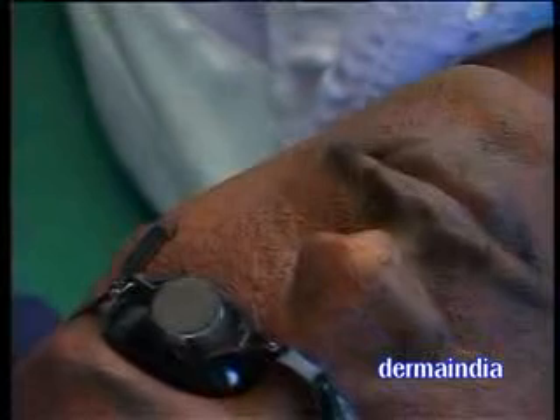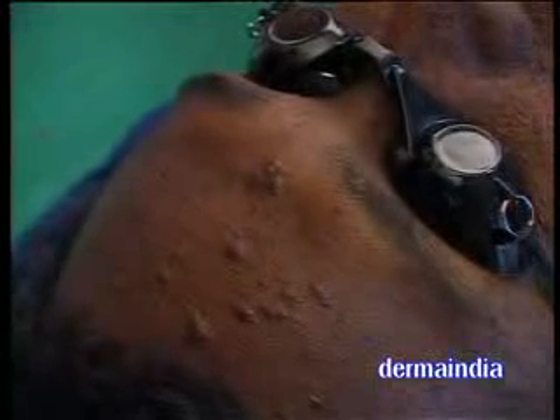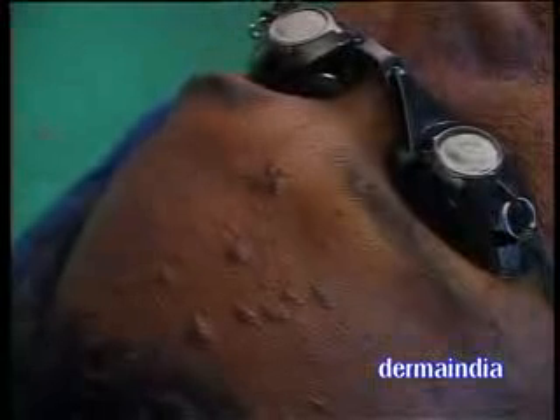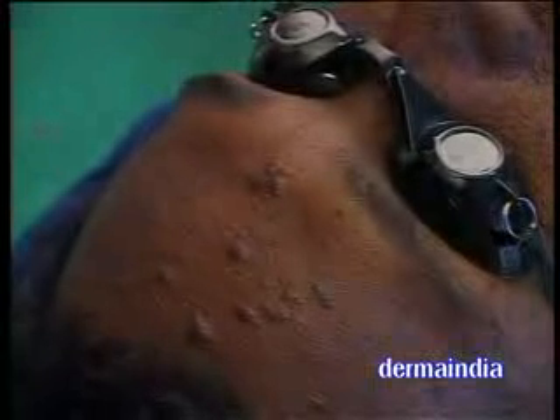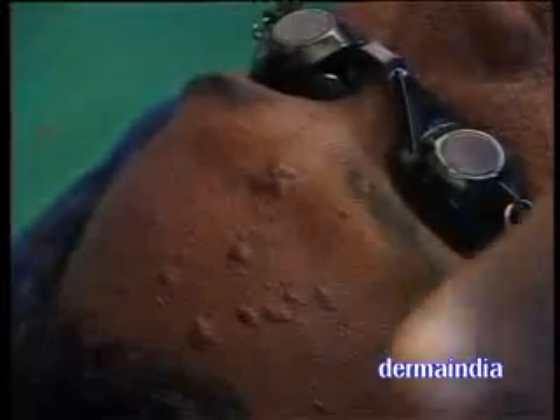I will just show you about the ultra pulse. Ultra pulse — I will reduce the size from 10 into 10. I will be demonstrating on this lesion which is around 6 mm, keeping the energy at 20 millijoules. I am choosing the square. This is energy repeat — I am keeping it at 1, because if I keep it as 2, then 20 millijoules into 2, that is 40 millijoules the patient will get.